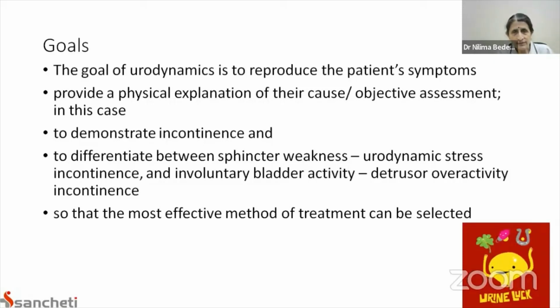Why are we discussing these urodynamic test results? Because as a physiotherapist, we don't do this test. It requires specialists to do this test. But when our patients come back with the urodynamic assessments, we need to interpret these findings correctly to incorporate them into our management goals. Hence, we need to know what the different urodynamic studies being held are.